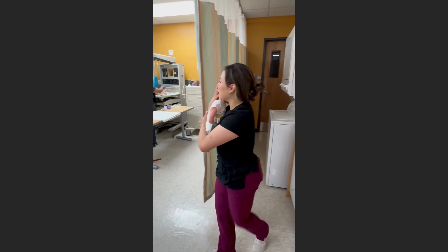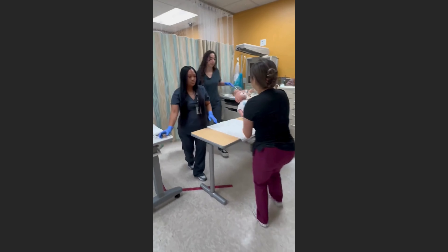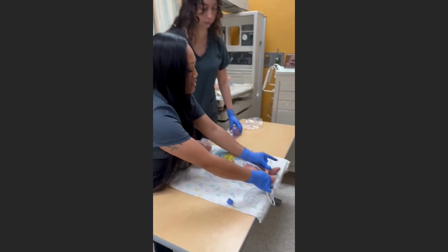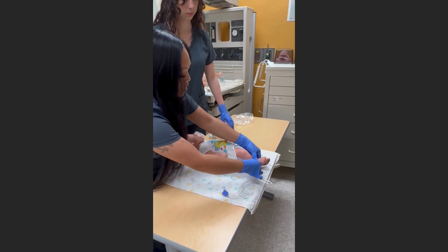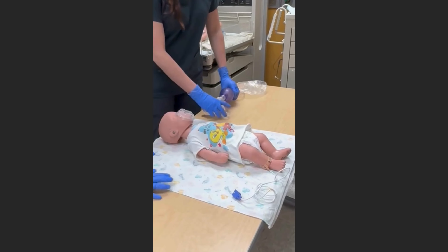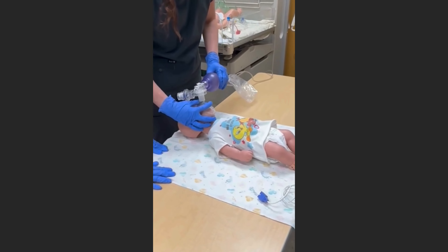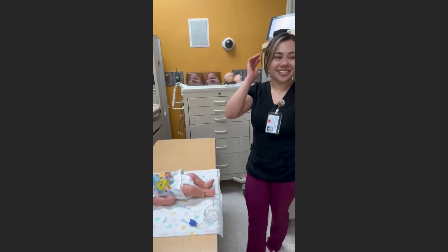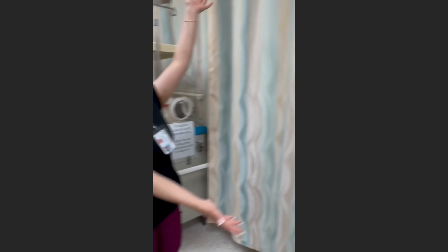In this scenario at Carrington Hospital, a parent reports the baby is not breathing properly. The team places the pulse ox and finds the heart rate is under 60, so they start PPV. With no visible chest rise observed, the team identifies this as an indication for Mr. SOPA.